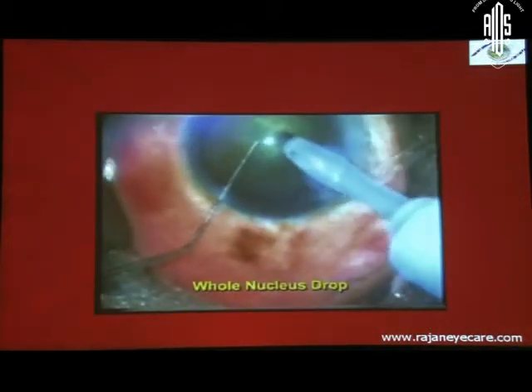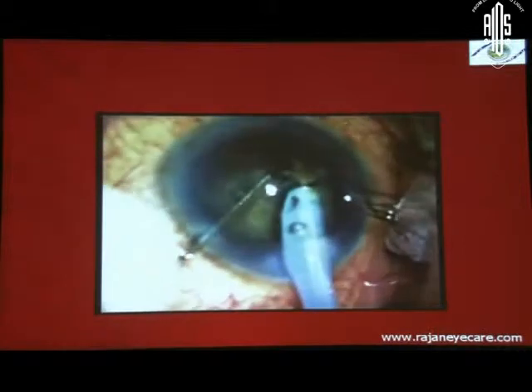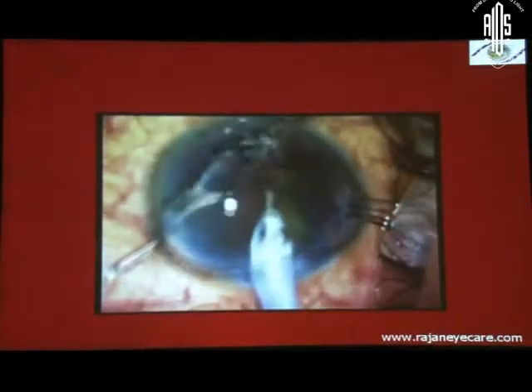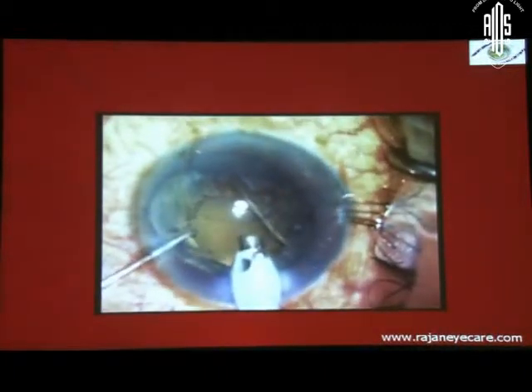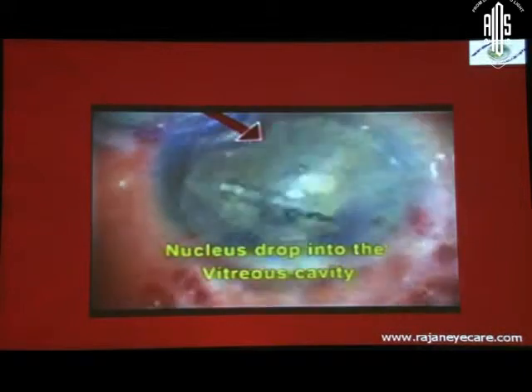So this is another patient. You can see here, as soon as I started, the nucleus went in, that is hydrorupture. This patient has a dense brown cataract, a VIP patient, the former union minister, and my assistant put the viscoelastic on the cornea and pushed the nucleus inside. Am I right? So first I showed AL, second I showed PAL, and this is a fall. But don't try to do the AL and PAL for this particular situation.